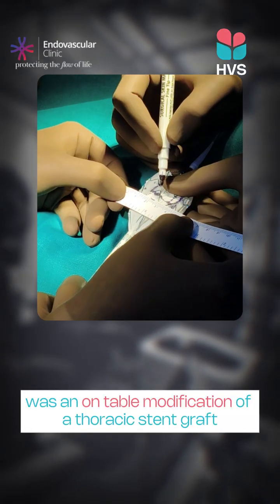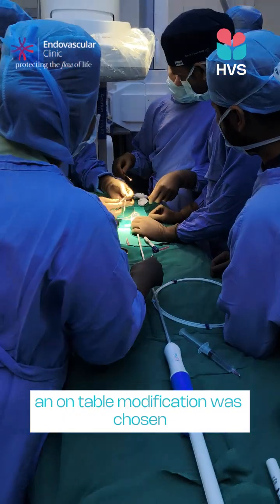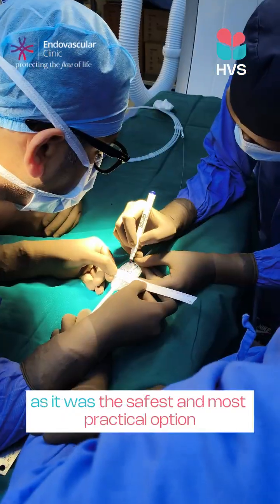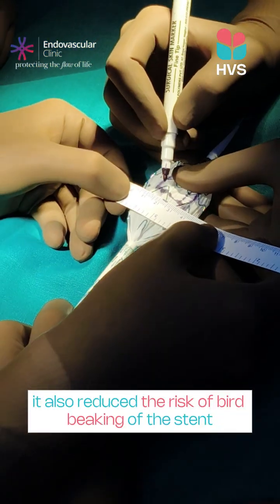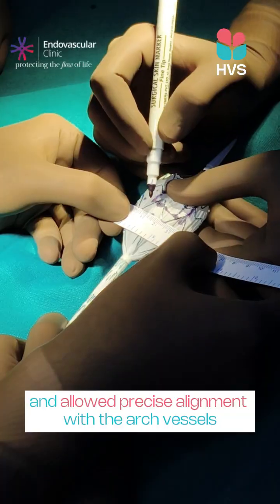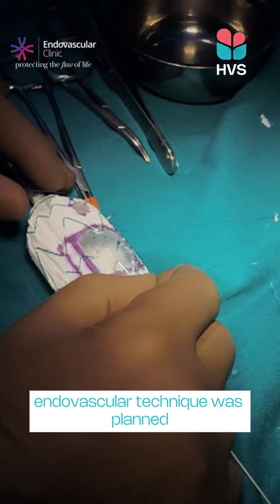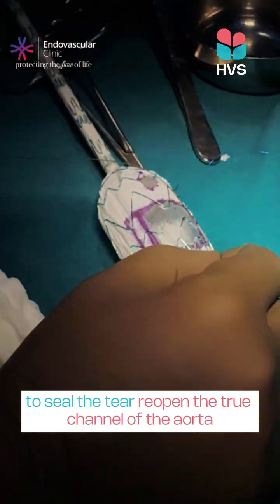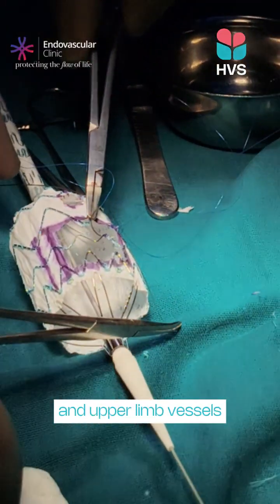The third option was an on-table modification of a thoracic stent graft. An on-table modification was chosen as it was the safest and most practical option in this case. It also reduced the risk of bird beaking of the stent and allowed precise alignment with the arch vessels. A physician-modified thoracic endovascular technique was planned to seal the tear, reopen the true channel of the aorta, and preserve blood flow to the brain and upper limb vessels.